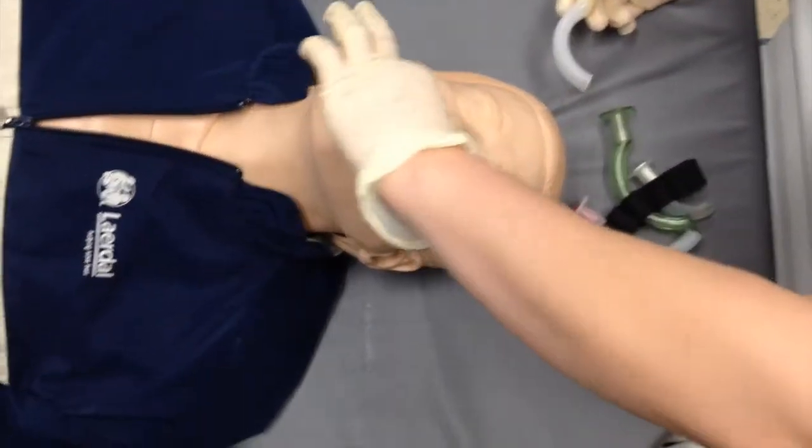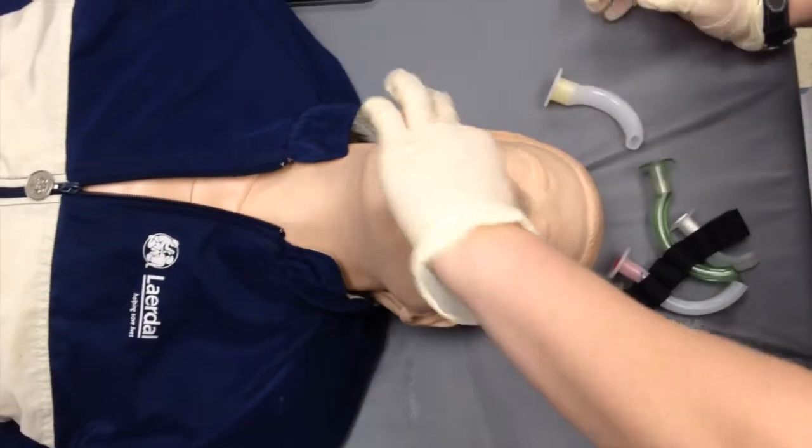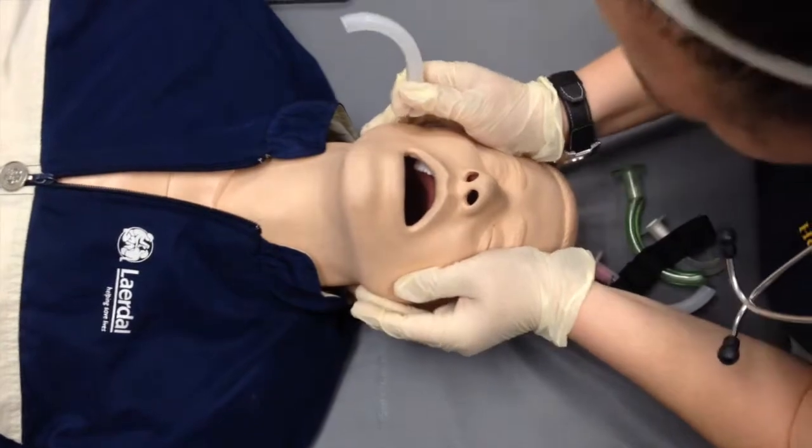Open the patient's airway by using a tongue-jaw lift or crossover finger technique. Perform a visual inspection of the oropharynx before inserting the airway.